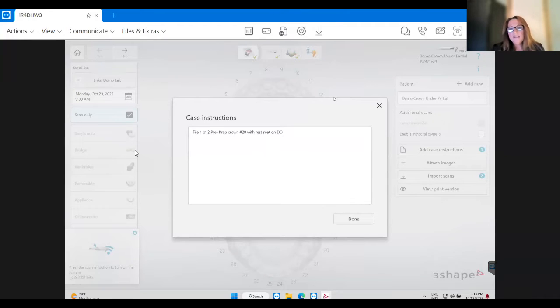And that's important for them to know because unfortunately, none of the scanners have an unlimited amount of libraries or scans that you can take. So I wish scanners allowed you to take 4 different scans, but it doesn't.